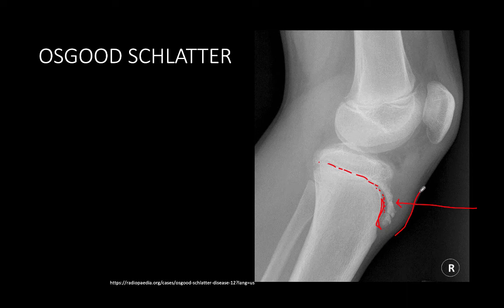You need the patient to have the right history, you need the patient to have pain and tenderness at that location, and also swelling radiographically. And that's the most important point, because through normal development, the tibial tuberosity can be quite fragmented, similar to the calcaneal apophysis. And so the appearance of the apophysis, unless it's avulsed, is really less sensitive to Osgood-Schlatter's than the soft tissue swelling that should always be present over it.